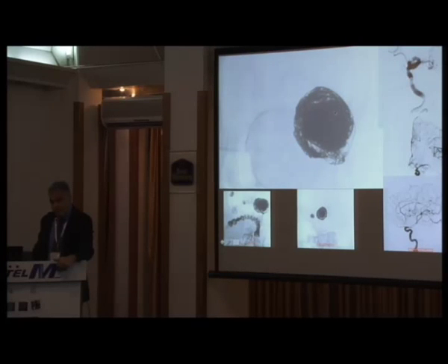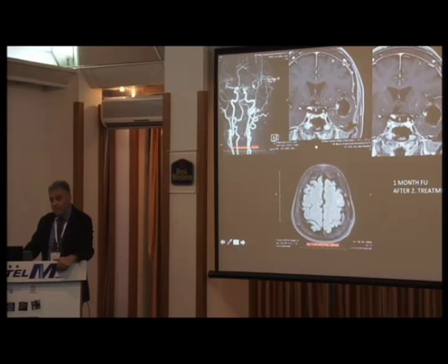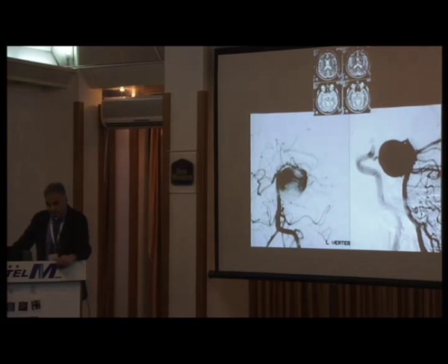So at that time we used a pipeline on the lower branch to change the hemodynamics totally. At the same time, we coiled that regrowth portion. After coiling it, this is the 1-month follow-up. Look at the reduction of the cerebral edema. We didn't give any steroid to the patient. Just by reducing the pulsatility effect, you can get such an environment in the brain. I'm still following this case, with no problem. We realize the hemodynamic effect is much more important for complex cases.